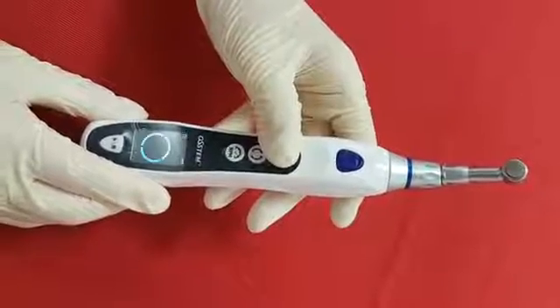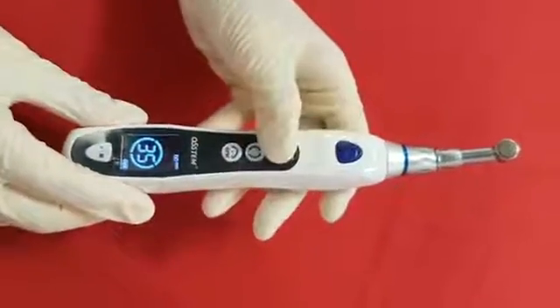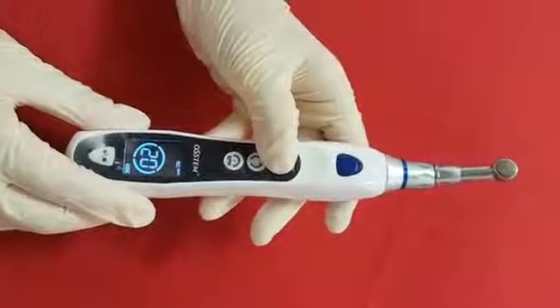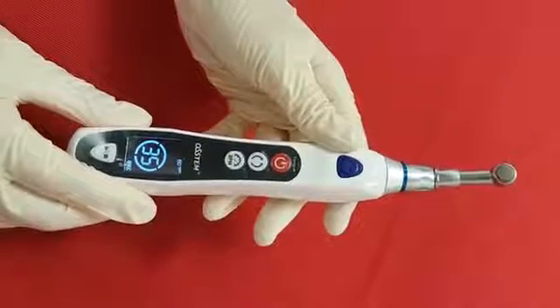This red button has another function, which is to control the torque value. You will see the torque mark here. Torque value increases by 5 Newton-centimeter when you press the button, and the applicable torque value is from 5 Newton-centimeter to 35 Newton-centimeter.